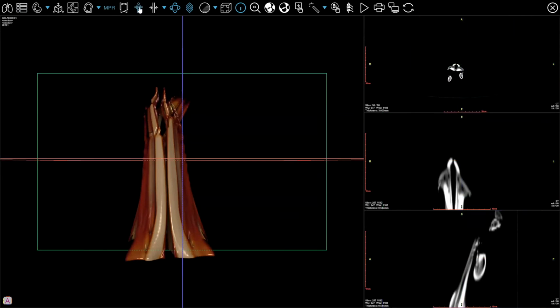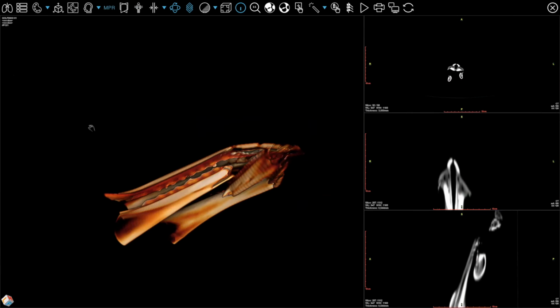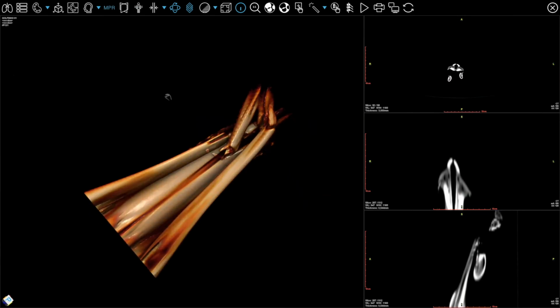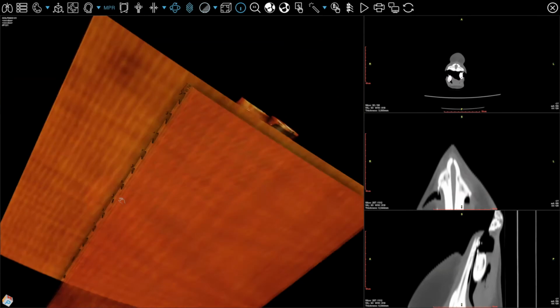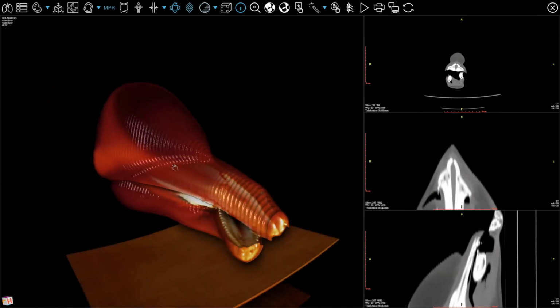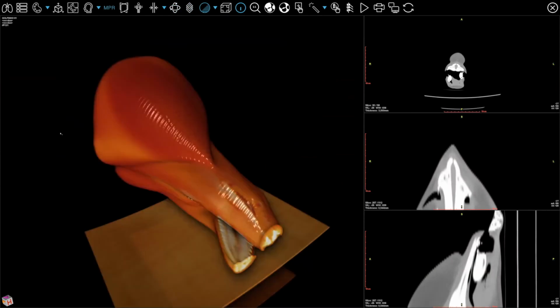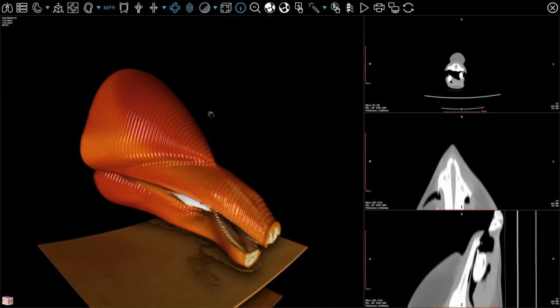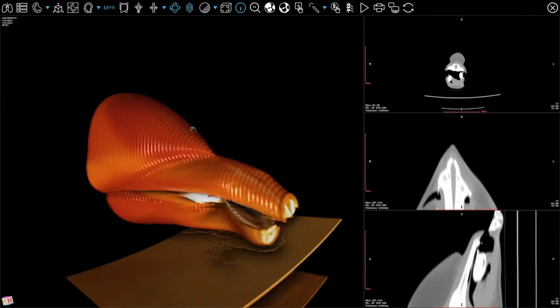And we also saw the lesion it had in its mouth. This is from when it jumped out of the tank and crashed its mouth and broke it, and couldn't eat anymore. That's why the animal passed away. You can see how realistic the 3D reconstruction is, and you can see exactly the break in the mouth for a very accurate evaluation of what happened.